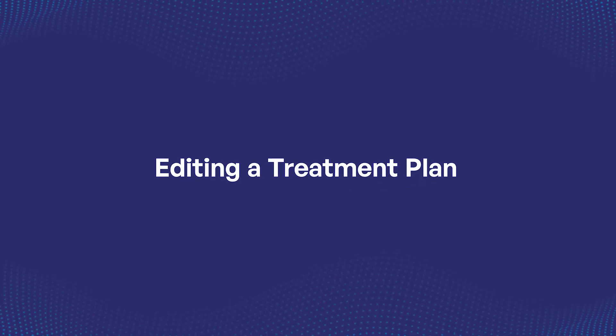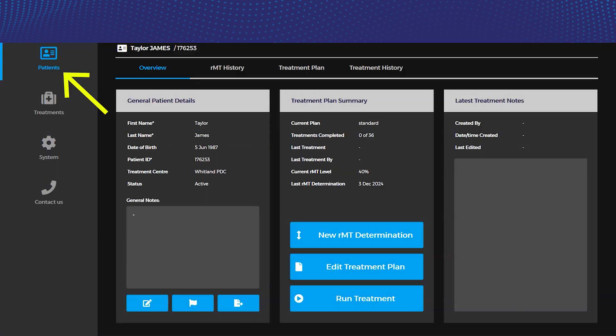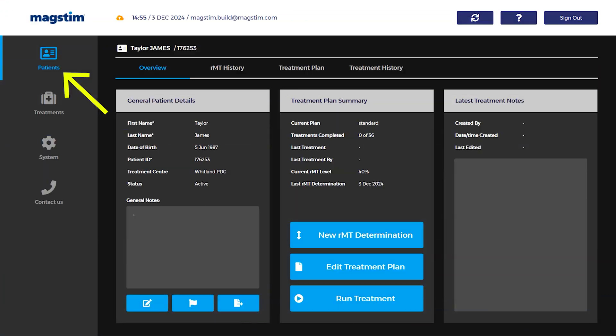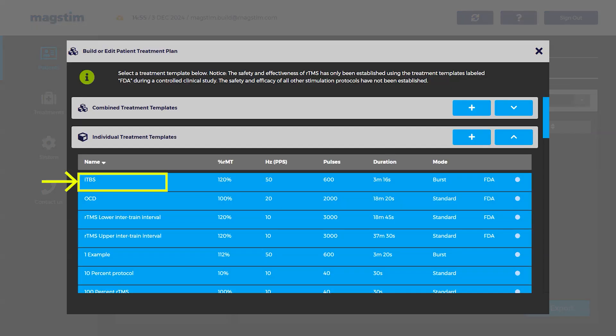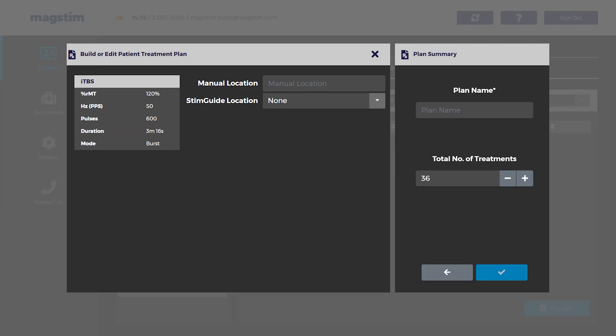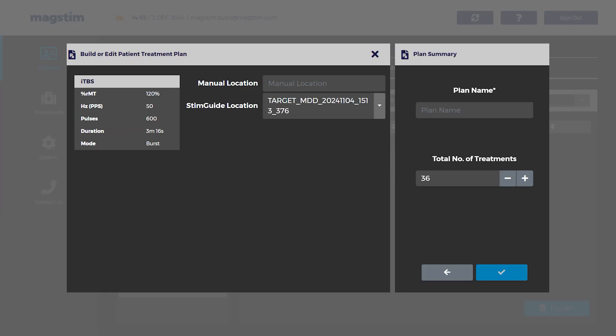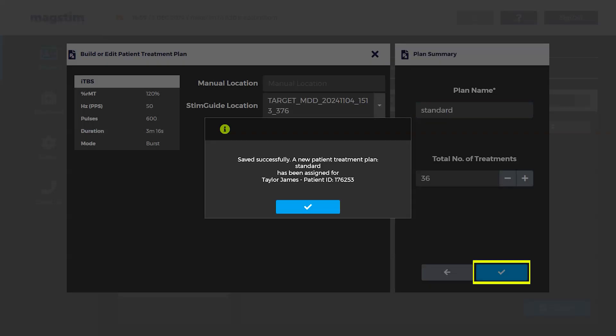Editing a treatment plan: On the patient record, within the treatment plan window, select edit treatment plan. Adjust the patient treatment plan using the same steps to assign and finalize the original treatment plan. Press the check icon to save the adjusted treatment plan. Note that the new treatment plan will be assigned to the patient and the old treatment plan will be archived. The system does not allow for two treatment plans with differing motor threshold values. Combined treatment templates should be used to achieve this.